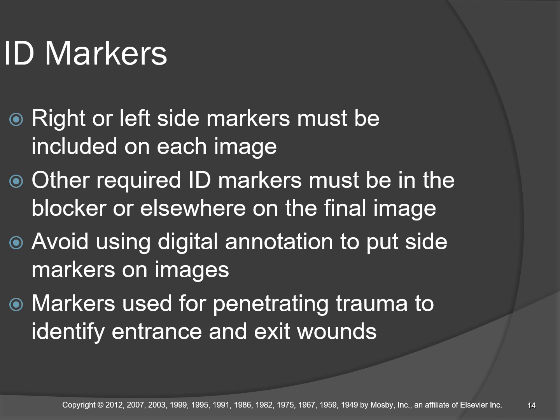ID markers are more important than ever. And a lot of our projections in trauma radiography are cross-table projections. That means vertical image receptors, so make sure your tape is fresh going into a trauma exam because your marker is going to need to stick to a vertical surface. Okay? Avoid using digital annotation, especially in the case of trauma, because it affects the legal status of the X-ray as a legal document.